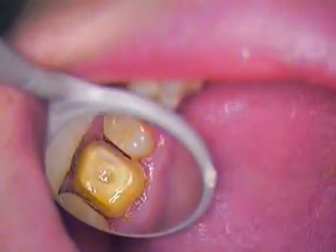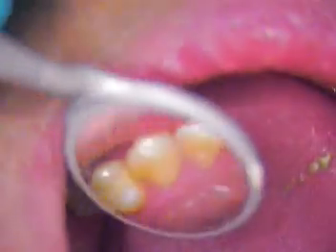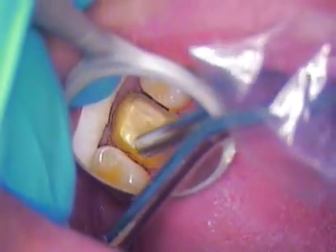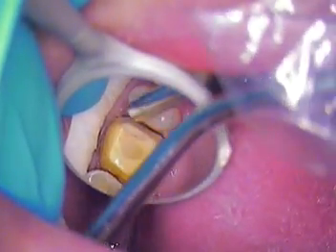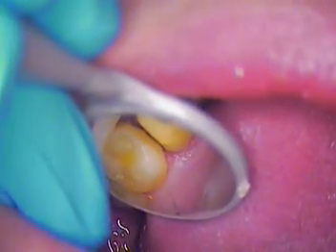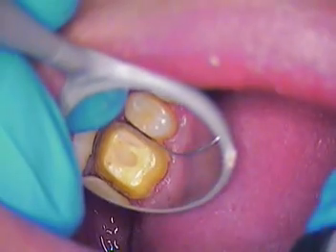Okay, I'm gonna keep you guys in the dark. But we are here. Okay. There's our tooth. Now we've got to make sure it's dry in there. That's important. I like to try to keep that cord in place if we can. We just had a little bit of it pop out of there, but that's okay. Let's stick it back in place. Cord's going back in.